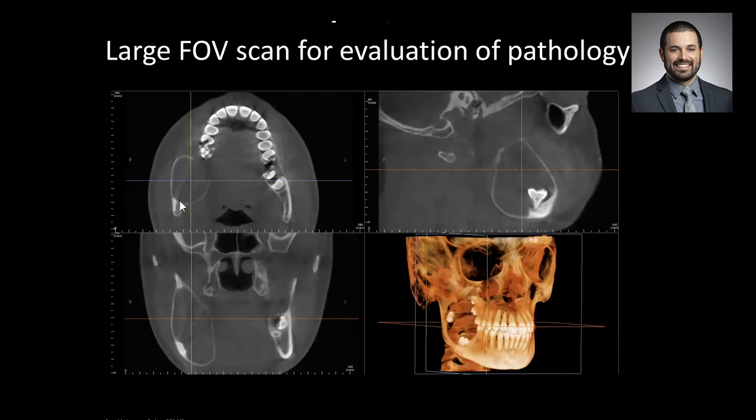What was going on? What that surgeon didn't recognize is this rendering was misleading, like we discussed last week. It basically took this outer shell of bone and eroded it away from the actual rendering, and that again reinforces my point: if you need to see the detail of where the bone is, you must be looking at the slices.